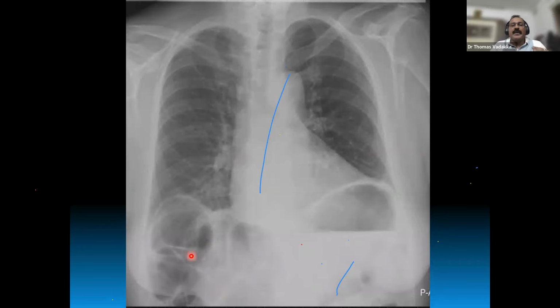This is a tricky situation. If this patient develops a pleural effusion or empyema, you will put the needle into the colon. If you put an intercostal drainage, you will puncture the colon. Finally, this will create a colonic fistula, where the drainage will not stop. So the patient will have feculent discharge through the ICD. So this is a tricky situation. So if your patient has Chilaiditi syndrome, when they present with something else like pleural effusion or empyema, you have to do it under image guidance.